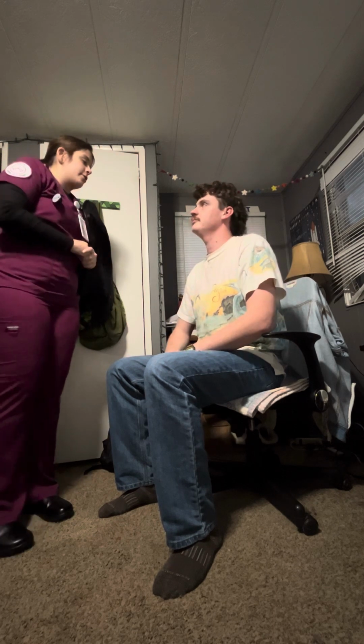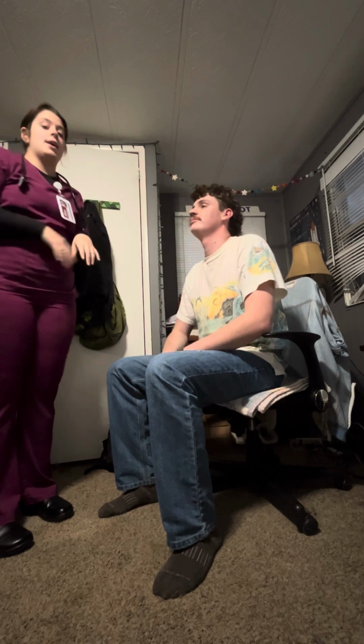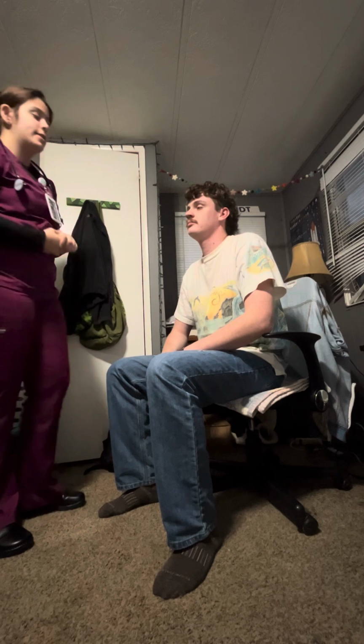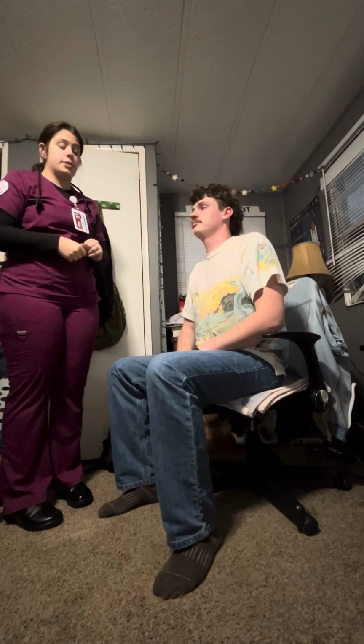If you'll state your name and date of birth for me. I'm Joey Davis. I was born July 2nd, 2001. Okay. I would wash my hands, and then I'm going to first assess his vital signs. I'm going to start with the temperature. It should be between 97 and 99 degrees.